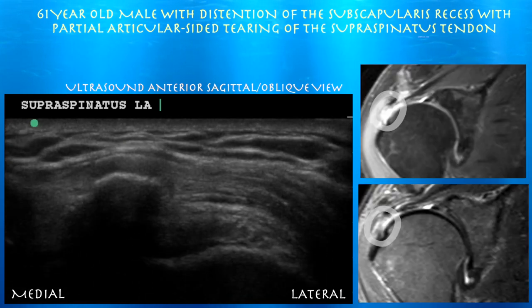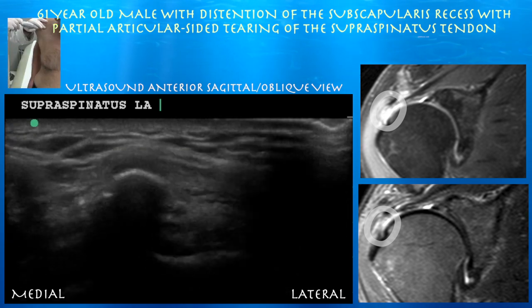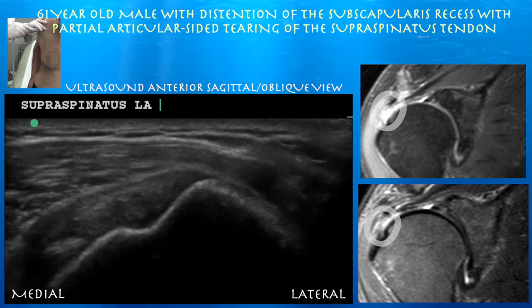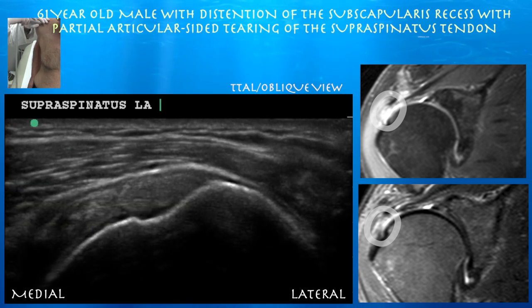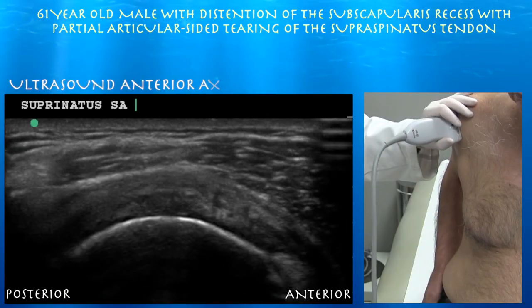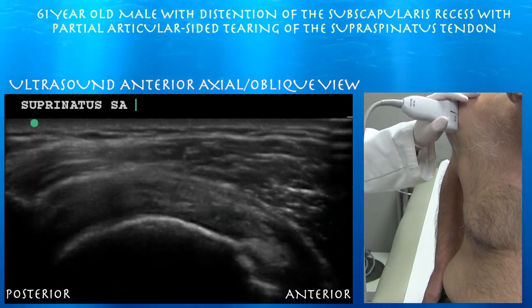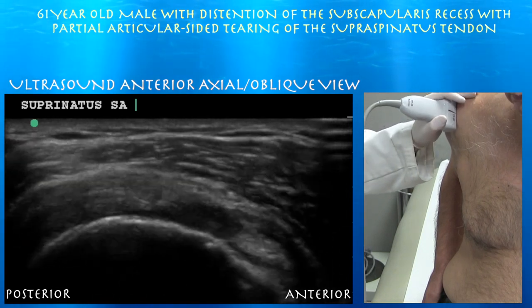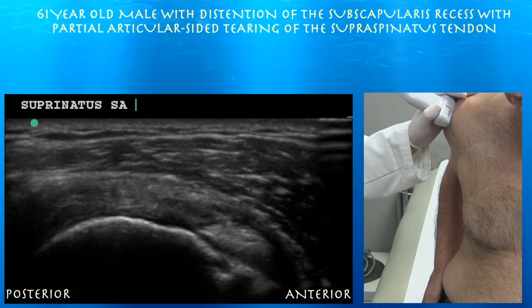On MRI sometimes you have to window the contrast, especially in fat-saturated sequences — when you window it you'll actually see tendon where you thought there wasn't. These MRI images are actually two different images: one shows mostly bright signal distal in the tendon, the other you can make out some supraspinatus tendon. Here we've got the biceps tendon in the groove, and here you can see a pretty thick supraspinatus tendon to the left of the biceps tendon in a tire-on-a-wheel type configuration.